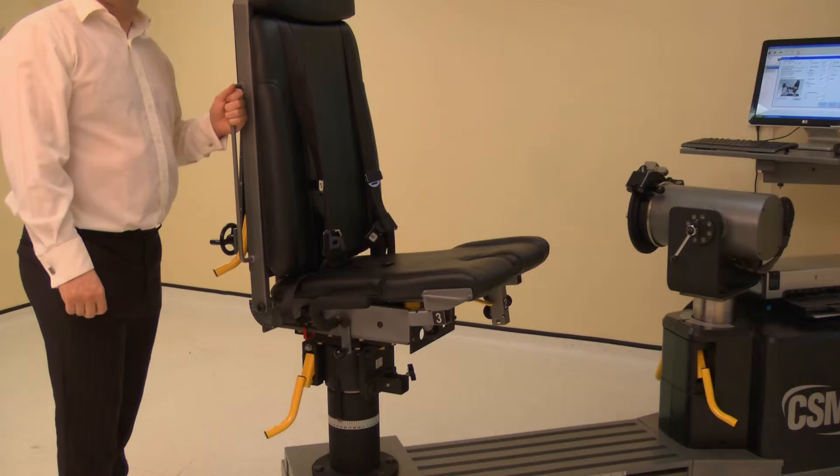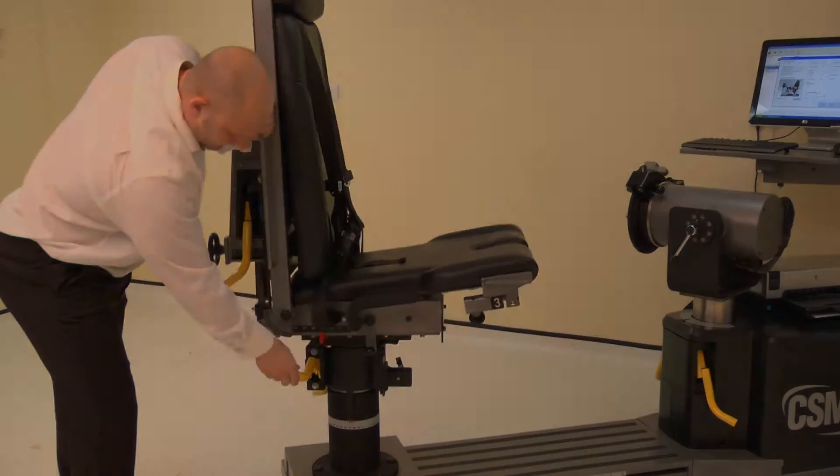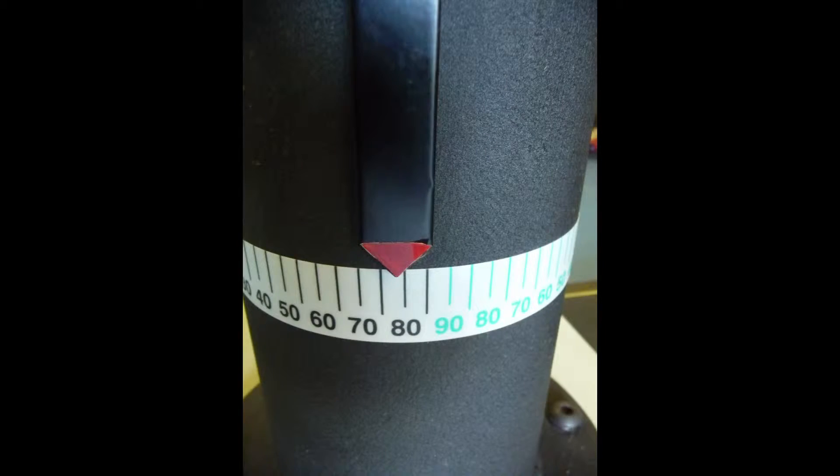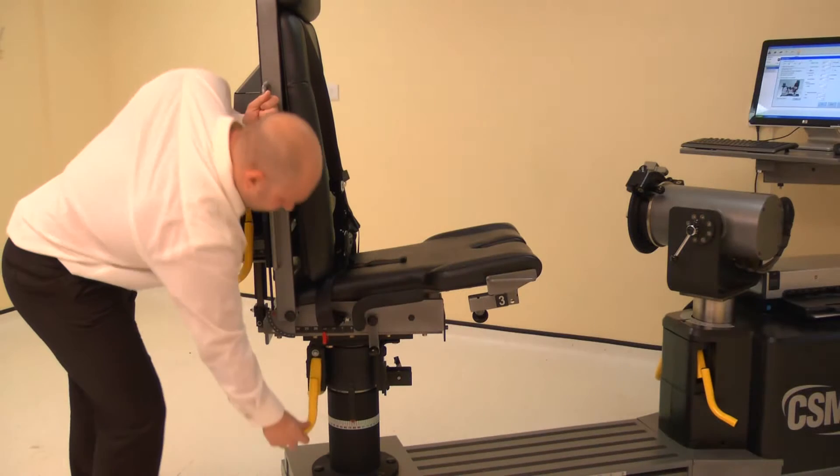Now adjust the chair rotation. Lift the locking handle and rotate the chair. Rotate the chair to 82 degrees on the black scale. Ensure both locking handles are pushed down to secure.